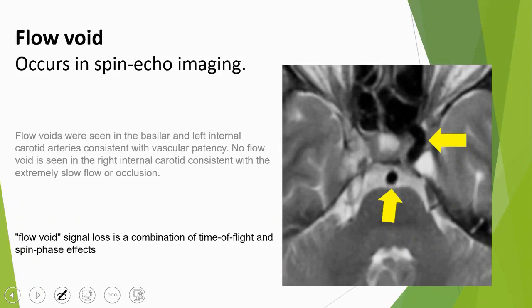This means that if I have a vessel in the spin echo sequence, like the jugular vein, for example, and its blood flow is slow and gives me a signal, you might detect if there is even stenosis or a specific pathology causing the blood flow to slow down. You can benefit from this property in your diagnosis. The whole idea of the flow void is that the blood has moved from its place. This is in the spin echo.